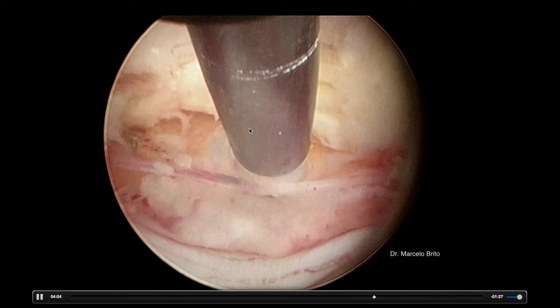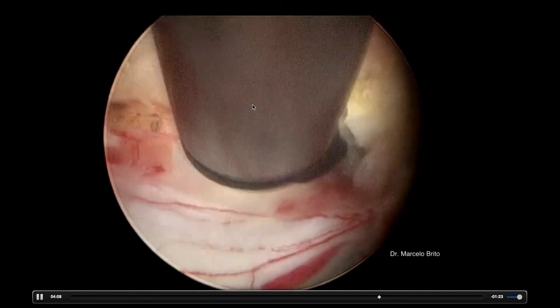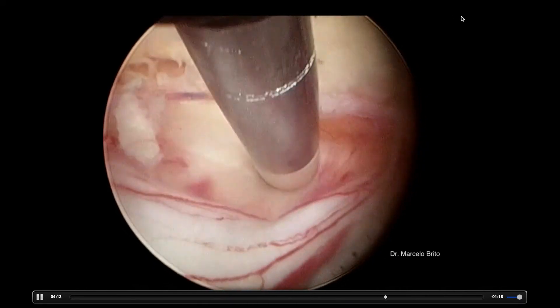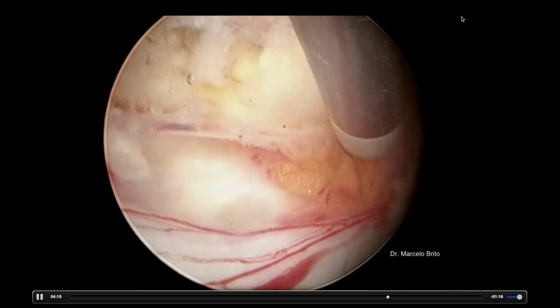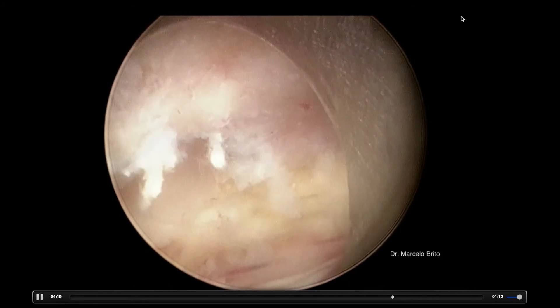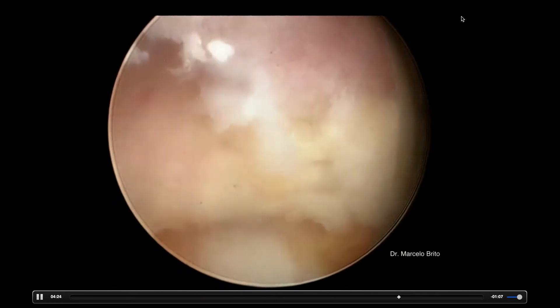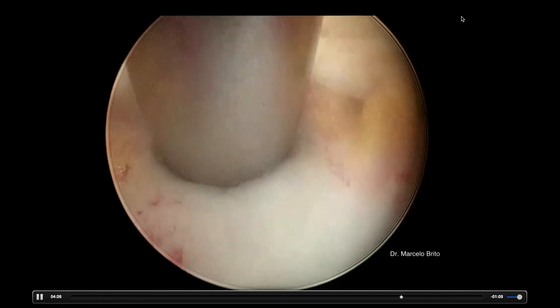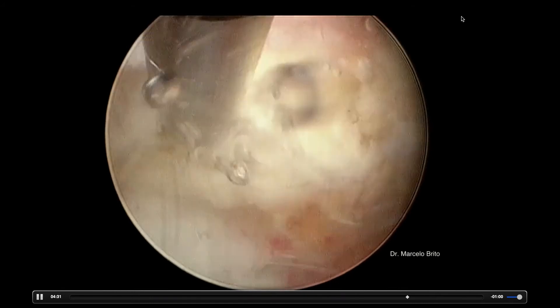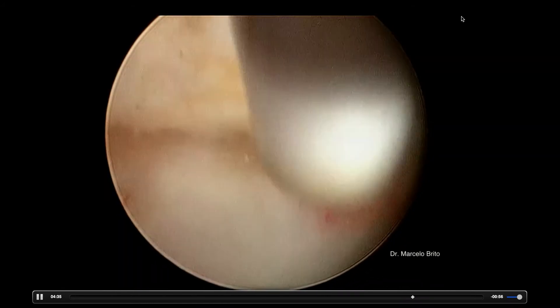When we move the dural sac, we see in white at the bottom of the image the disc. So we can address herniated discs from the other side, foraminal stenosis, and lateral recess stenosis — you can reach whatever you want to decompress it completely. We see now the disc, the yellow ligament, and the lateral recess. We're going to clean it a little bit more to be satisfied with our procedure.